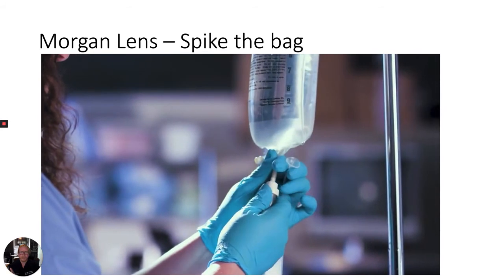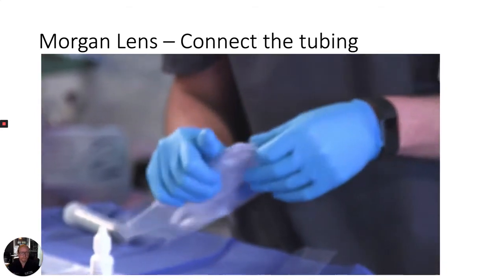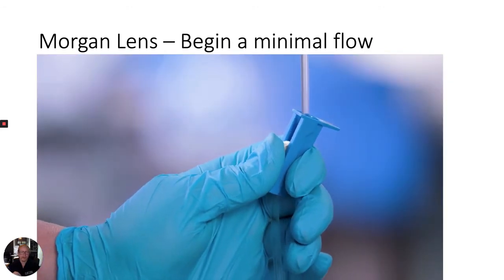Go ahead and hang a spiked bag of IV fluid on an IV pole above the patient. Leave the IV fluid flow off initially. Connect the tubing of the Morgan lens to the IV tubing. Begin a slow rate of IV fluid flow so that during placement of the lens, it can safely float on top of the cornea and not cause additional injury.